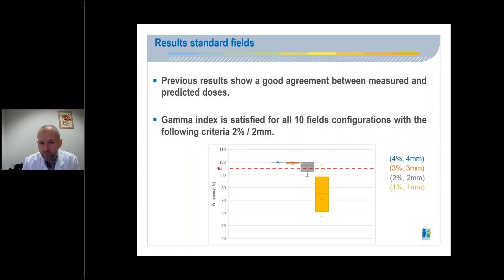From a statistical point of view, we represent the frequency of points respecting the gamma index. Four criteria were analyzed: four percent, four millimeters, three percent, three millimeters, two percent, two millimeters, one percent, one millimeter. Results show for the 10-field configurations, as we did, the optimal criteria, which is two percent, two millimeters, if we consider a 95 percent threshold. The point here, which is out of tolerance, corresponds to a detector positioning in the penumbra of the leaves.